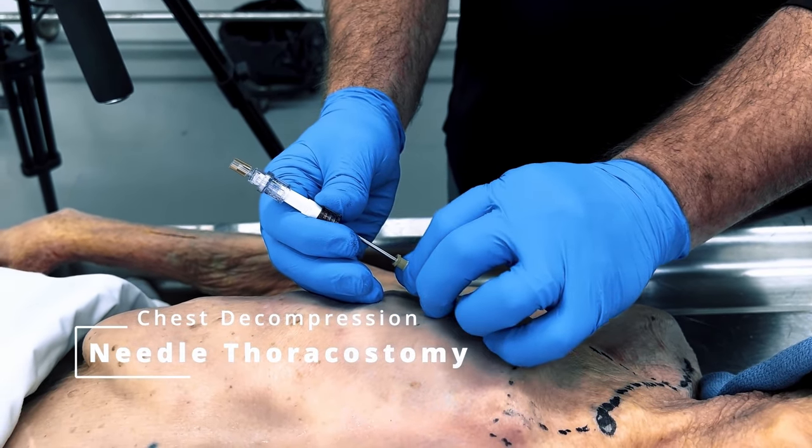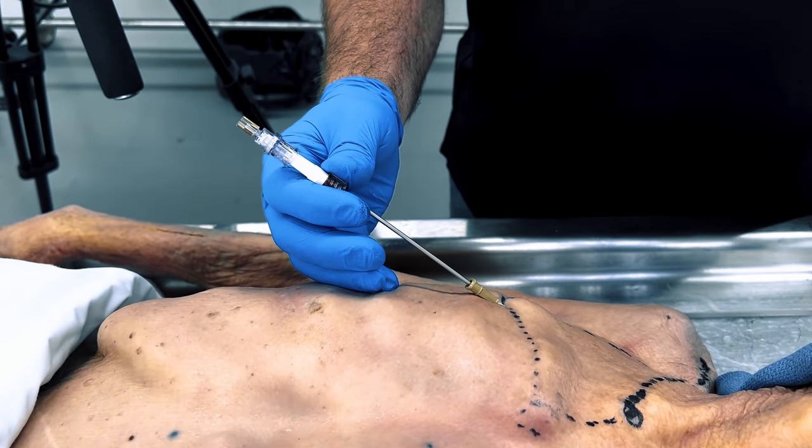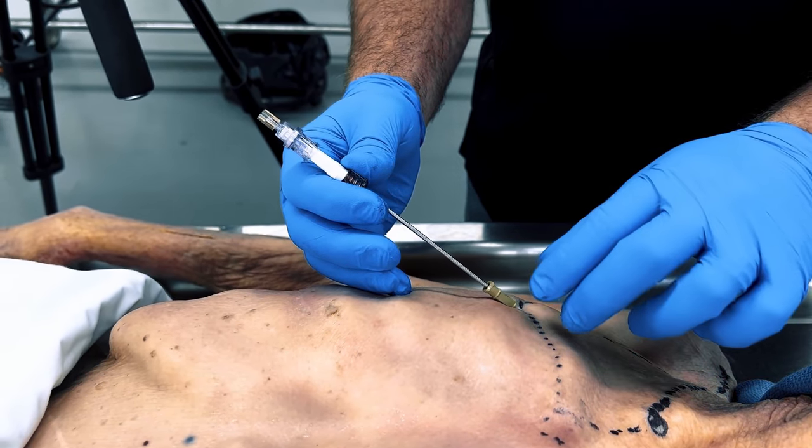Welcome to this instructional video on needle chest decompression. Today we'll demonstrate the correct procedure for performing needle chest decompression in cases of tension pneumothorax.